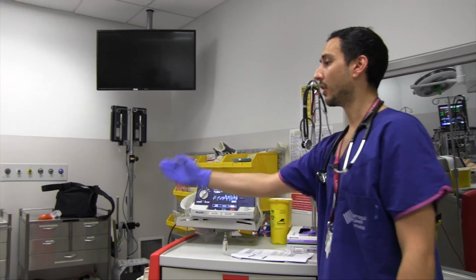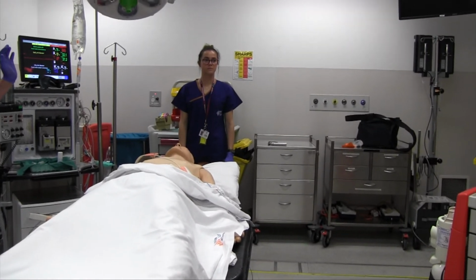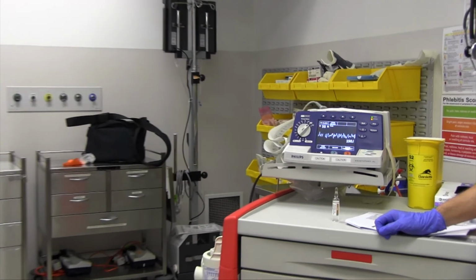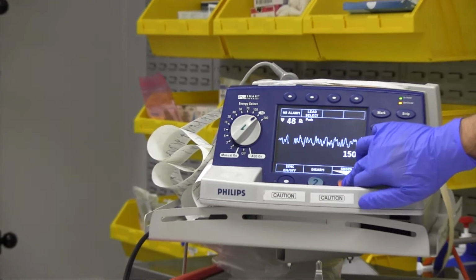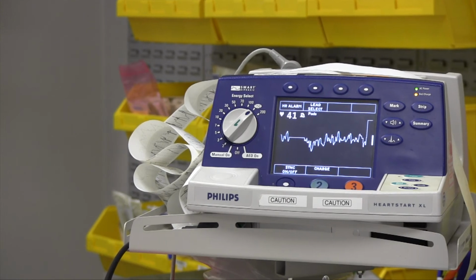Hands off. Top, middle, bottom clear. Rhythm check. Team leader, rhythm check. It looks like we've agreed. Yeah. Happy to shock? Yes. Shocking. CPR, recommence CPR.